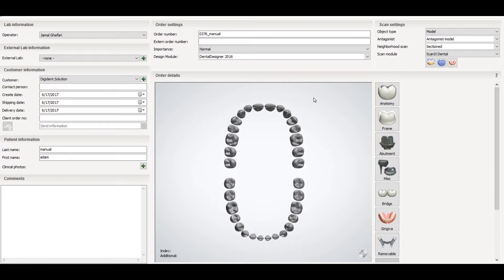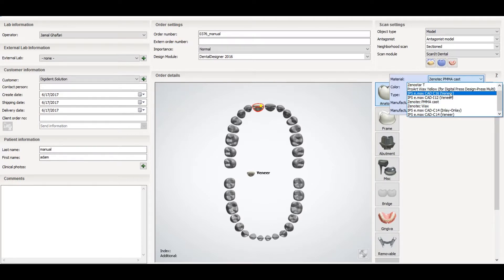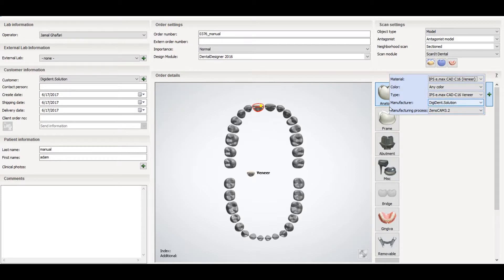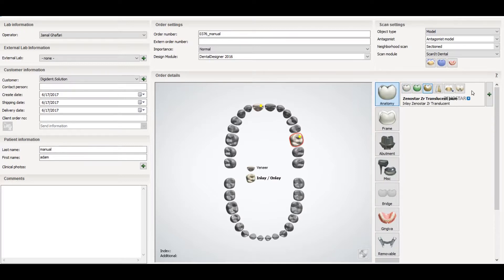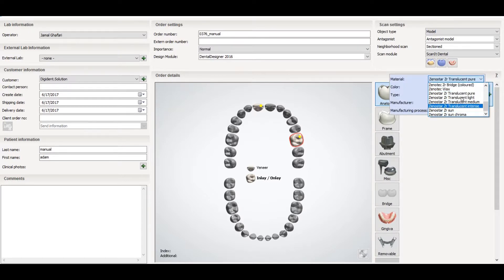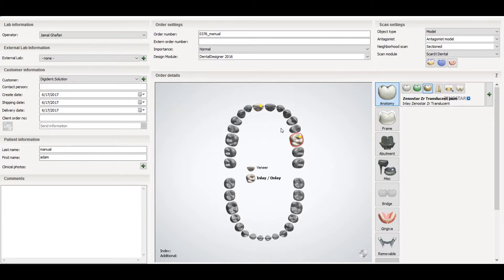Now let's talk about veneers, inlays, and onlays. Select the tooth you want to restore and go to the options for onlays and inlays. You will find the option for inlays and onlays. After selecting this, you will select the relevant restoration type. For material, you can select zirconium, IMAX, or anything you want. That covers inlays and onlays.